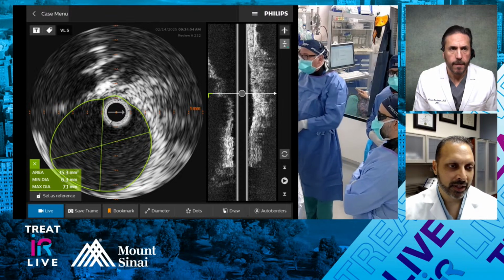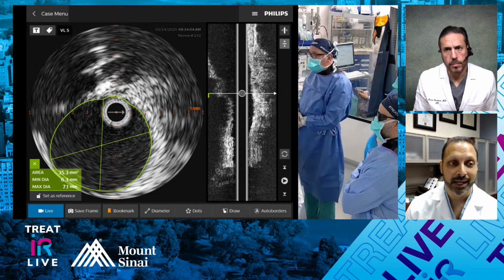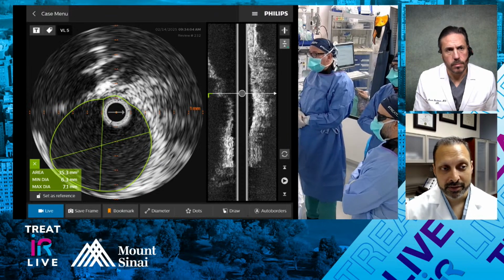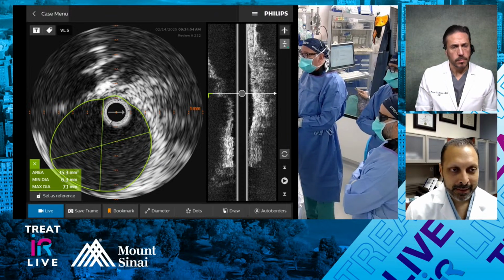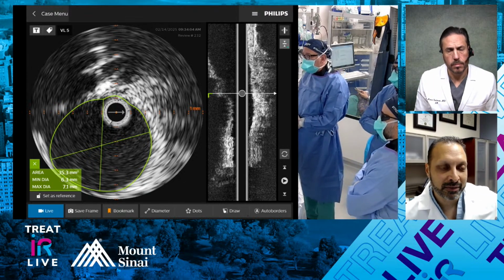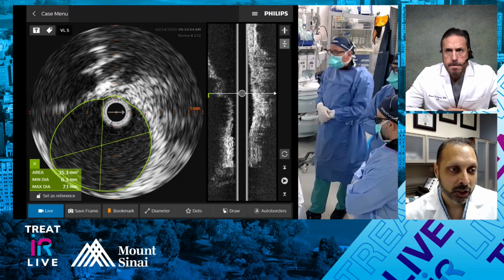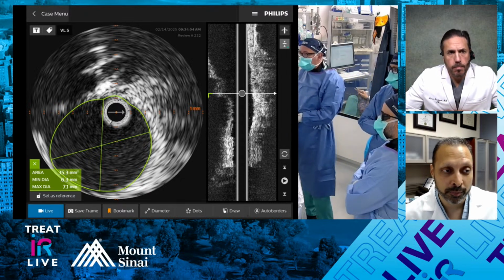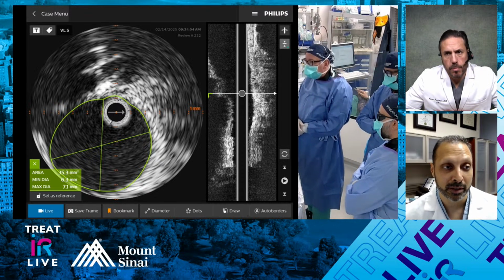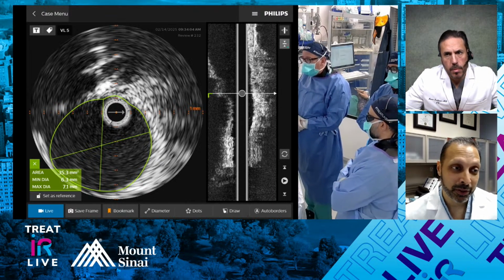I think it's 6.3. So if you go with the 6, you're going to have to post-dilate this to 6.3, 6.4. I suspect you have that max diameter at 7. It's quiescent. I always worry about these inflammatory patients, but you have a stent there, so you're not doing a balloon dilation where you worry about dissection. If you go with the 6, you're going to deliberately post-dilate this a little more. If you go with the 7, you're going to be very gentle and try to minimize how much you post-dilate. So you can go either way here.